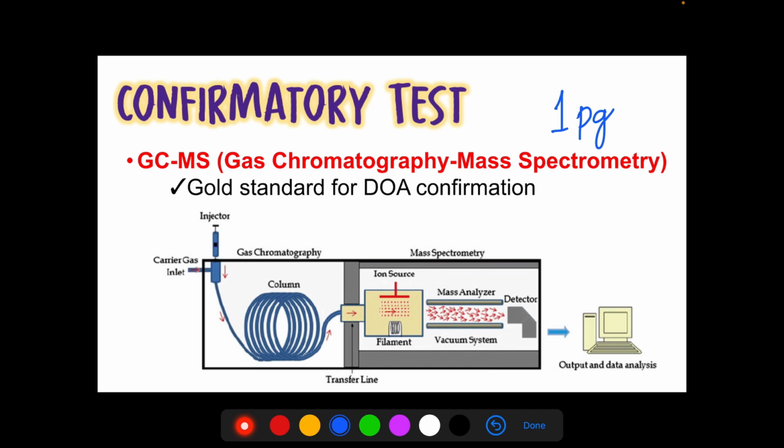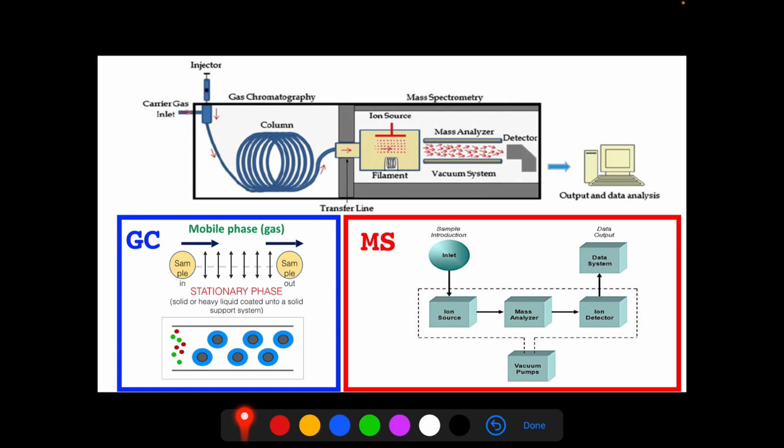Also, this GCMS is generally used to detect volatile and semi-volatile compounds, but it can also be used to analyze solid, gaseous, and liquid samples. Now this one further illustrates the GC and MS technique. As you can see in the GC, the main principle involved is partitioning.